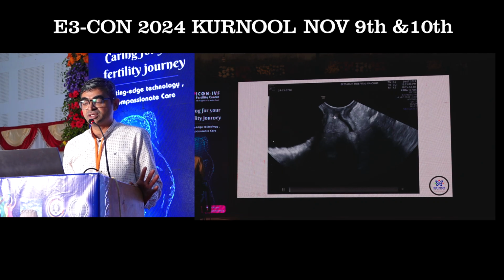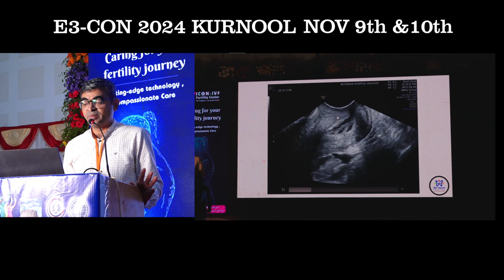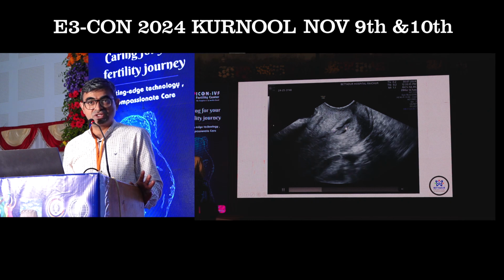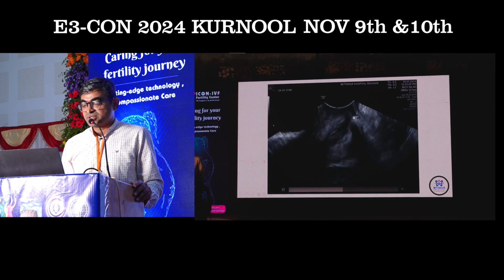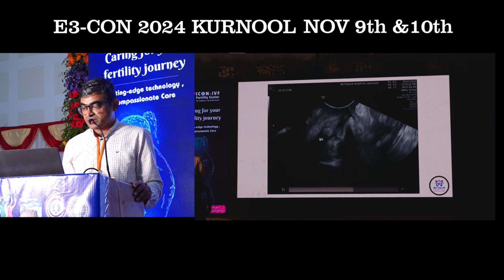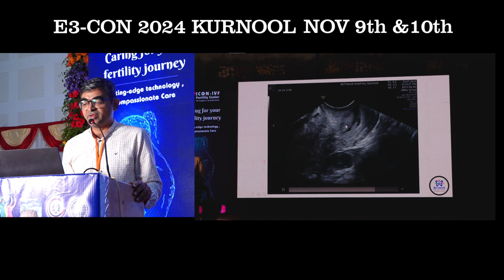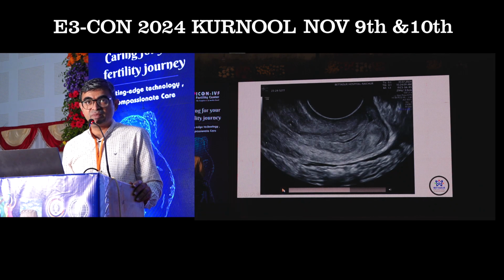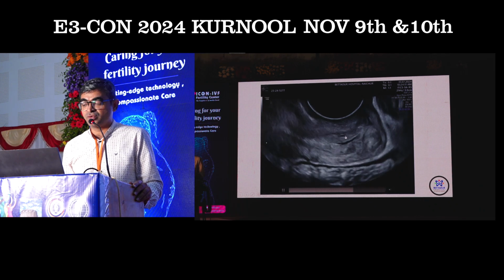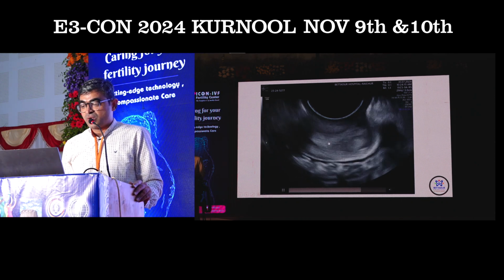If you have mucin or a plug, or if she is menstruating, any kind of fluid, it definitely tells me more information about the endocervical glands over here. These are appearing as normal endocervical glands. Sometimes we have to do a dynamic scan, where we put some probe pressure at the anterior fornix, or at the posterior fornix if it is retroverted, so that if there is any endocervical pathology going to protrude out to the external os, you will be able to appreciate that.